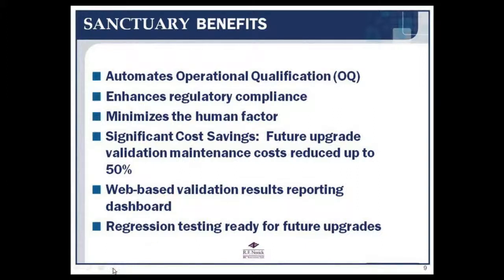If you have several different systems, you can run the same scripts on several different systems. You can show where these scripts have passed here, and they can show where the scripts have not passed. If you have to go through and redo a script, it's easy to pull up a script, recustomize it, and redo it. Significant cost savings.